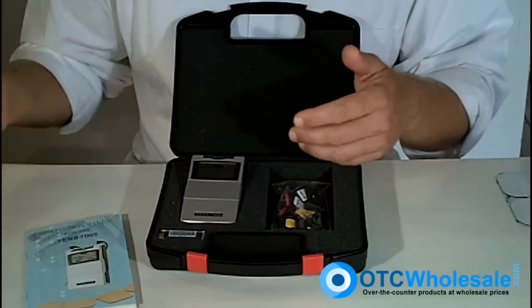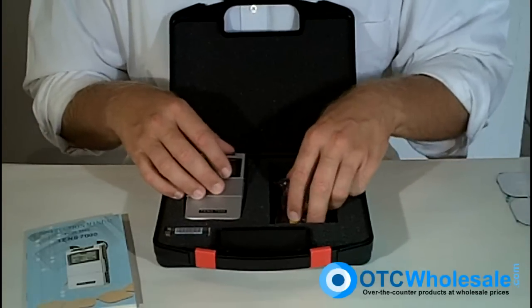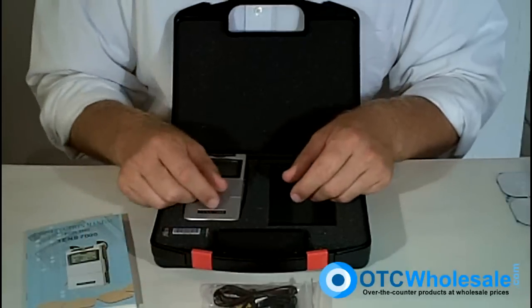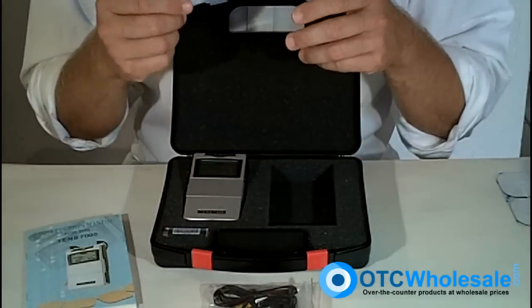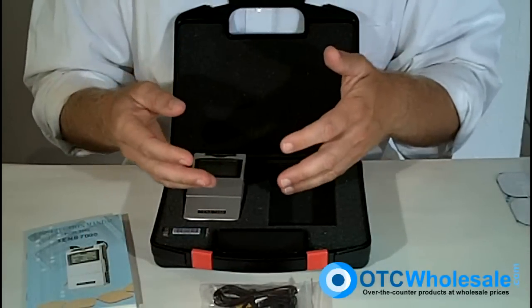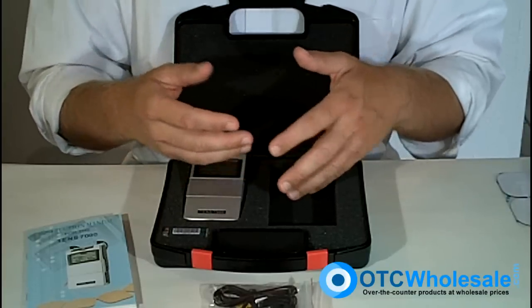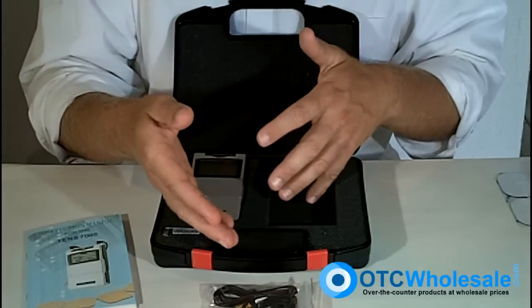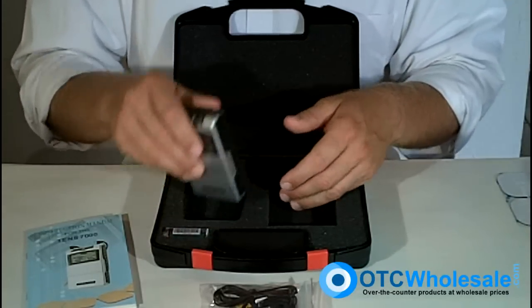You do get the four electrodes, though they're economy ones for sure. You get two wires. You can actually use four electrodes or two electrodes with this unit — it's a dual-channel unit, so you've got that option, with two electrodes per wire.